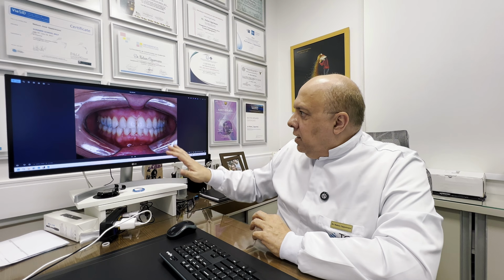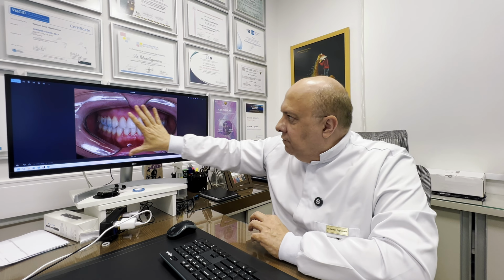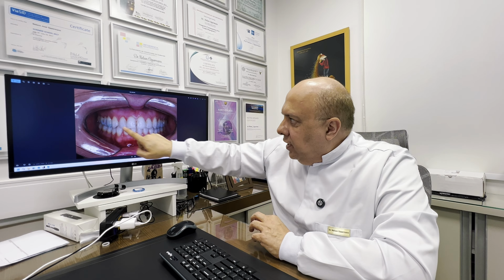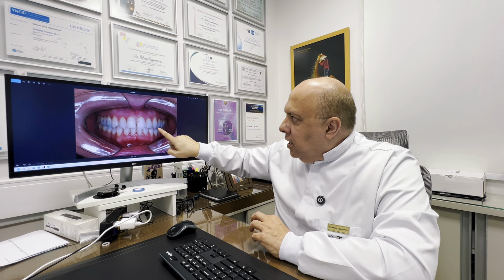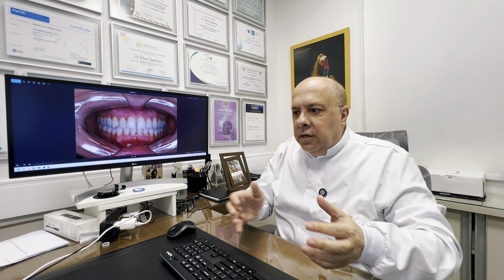Later on, we will remove them, okay? So now she has a completely open function. There's no more blockage on the anterior, no more blocked canine, all positive torque posterior, giving the patient freedom to move forward and side to side.